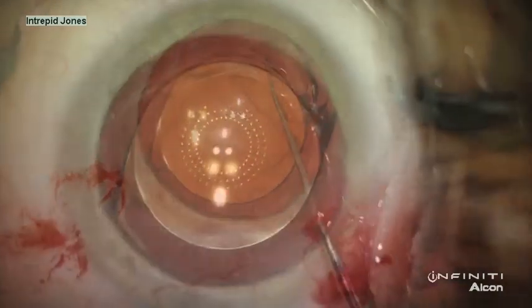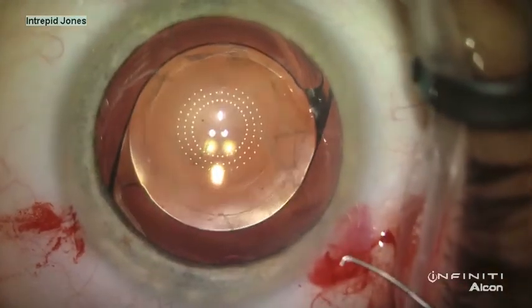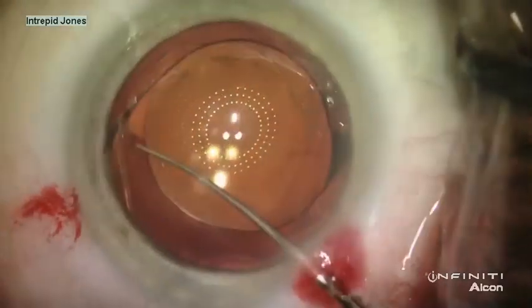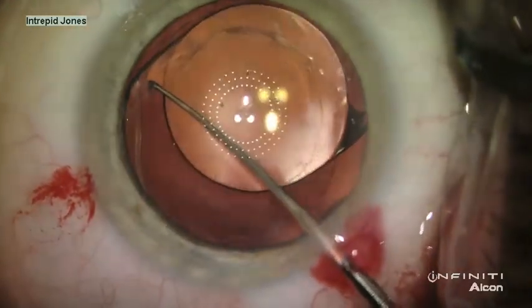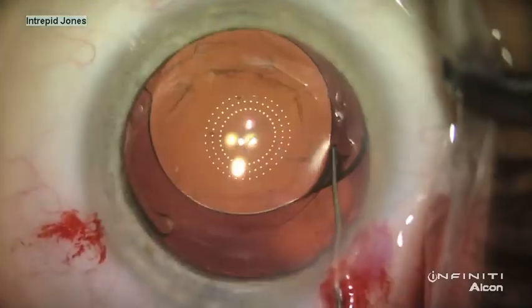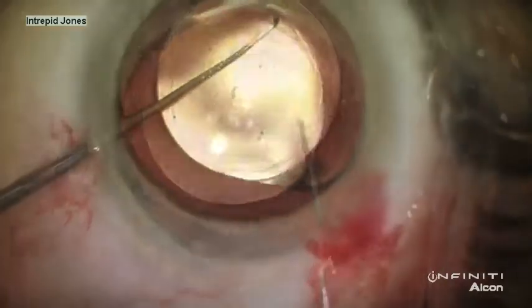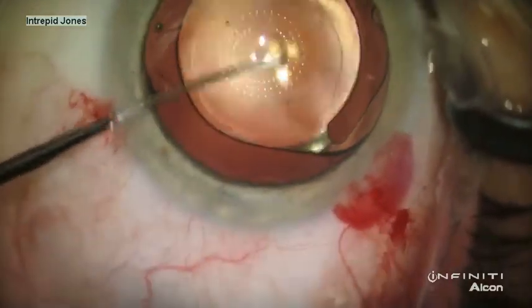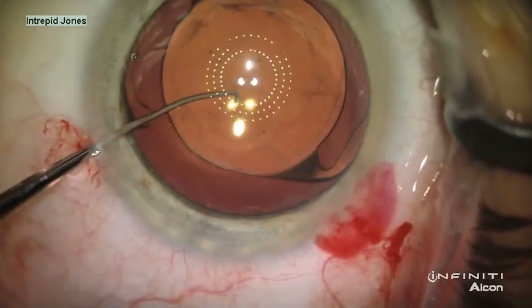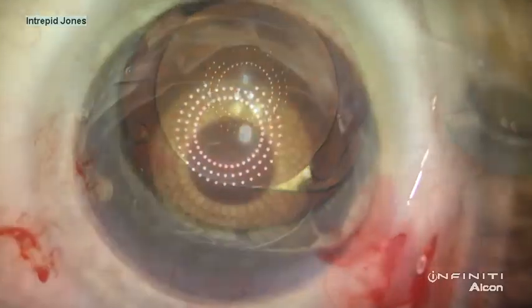With judicious and gentle visco-dissection, the lens is freed from its current configuration and rotated. Then the placement of the lens is confirmed to be centered using the fixation beacon and the concentric pattern of the keratoscopic reflections as compared to the diffractive rings of the restore implant.